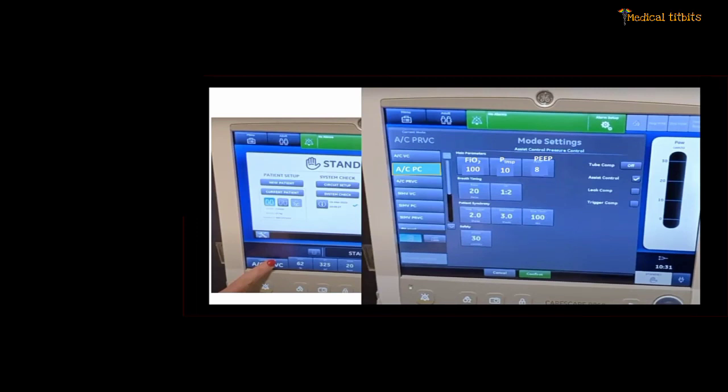In this case, I would like to go a little bit higher because I suspect the patient is in pulmonary edema following heart failure. Okay, breath rate of 14 should be sufficient, and I:E ratio 1:2 I'll go with. And for safety, I'll keep a pressure limit or P max of 40, because in any case, the circuit pressure, the system pressure will not go beyond 40.